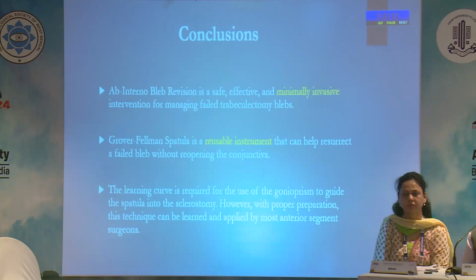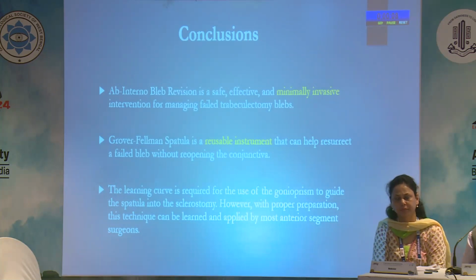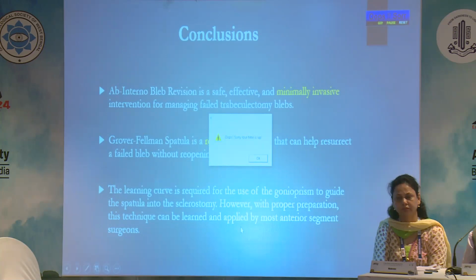To conclude, we found ab interno bleb revision a safe, effective and minimally invasive intervention, as it doesn't require reopening of the conjunctival flap and scleral flap. This spatula is a reusable instrument, and a learning curve is required, but it can be learned by most anterior segment surgeons. Thank you.